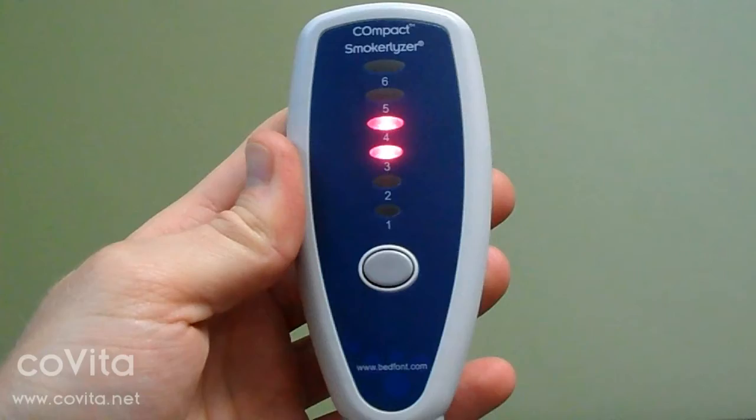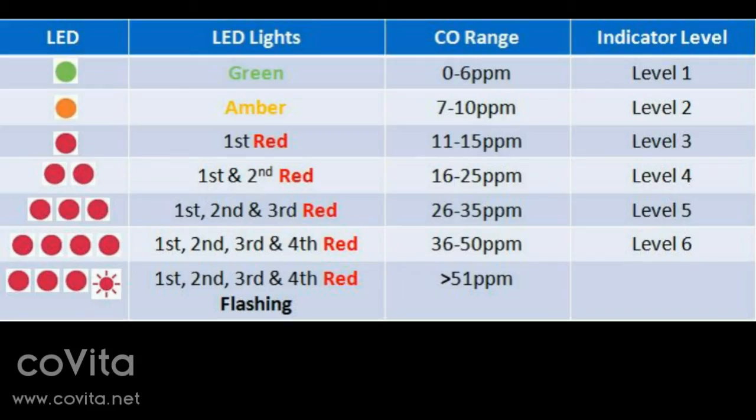The compact will then display the patient's CO level. Remember to refer back to the quick start guide for an explanation of the compact's different levels.